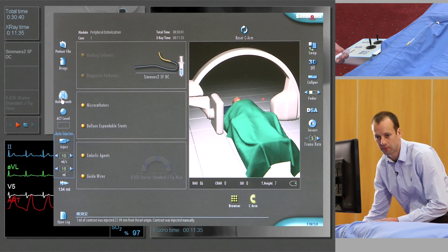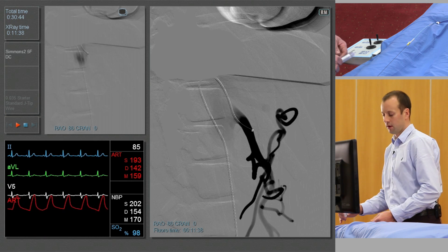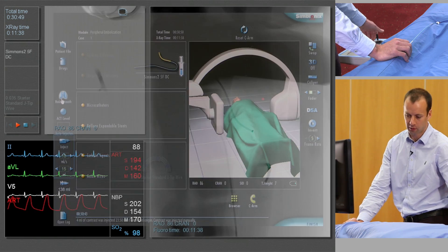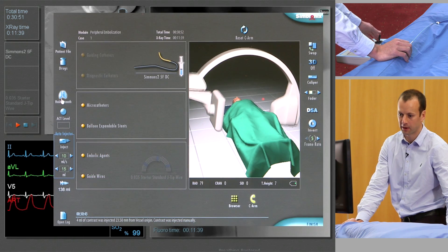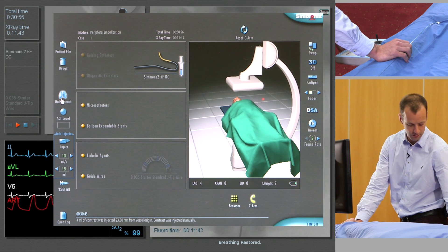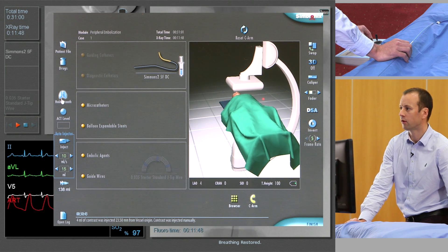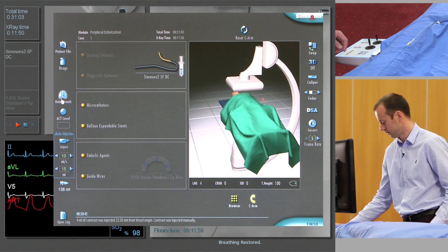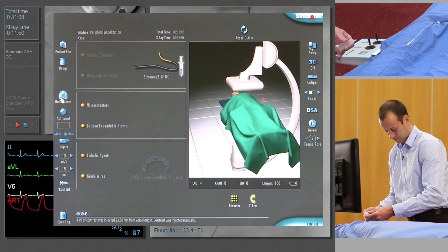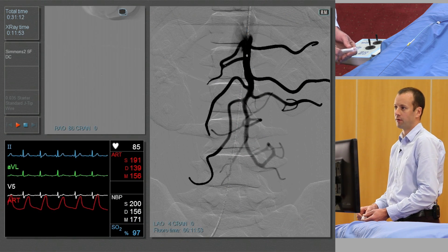Again, a breath hold is useful. And if we need to see a better view of the terminal branches, we'll look at the patient from an AP projection again. Center south, again with a breath hold. Inject by hand and a good view of the terminal branches.